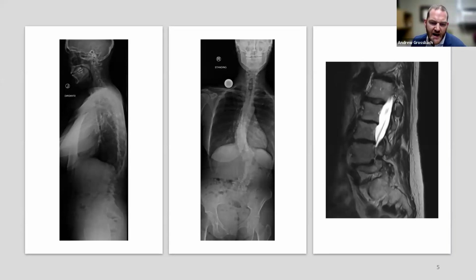And so you can imagine just looking at what particularly L4-5 looks like there. She has a lot of foraminal stenosis at her fractional curve, and that's what I'm trying to show here on this parasagittal MRI scan. So you can see that L4 foramen is pretty tight, L5 foramen is pretty tight. Just getting a lot of radicular symptoms from that.